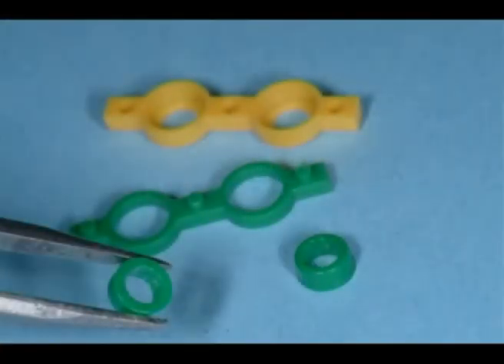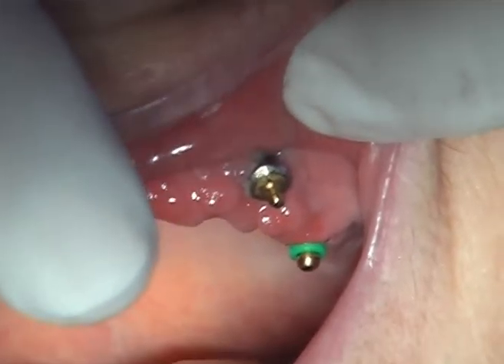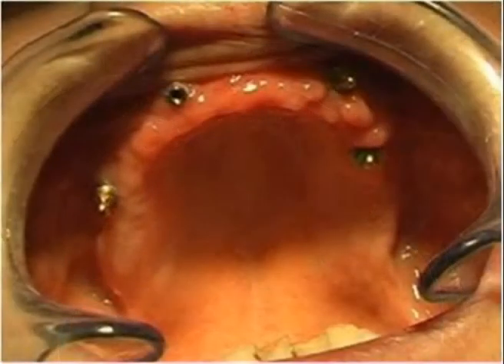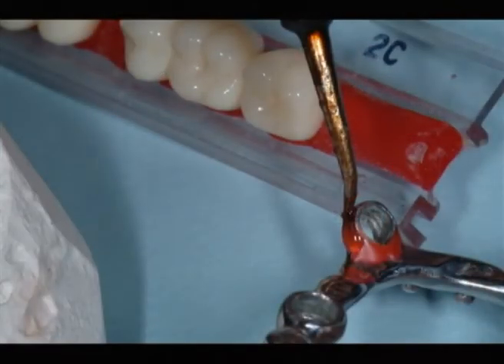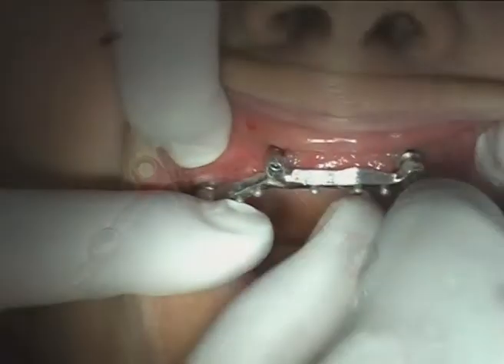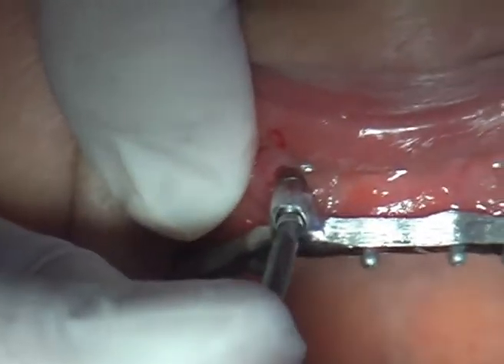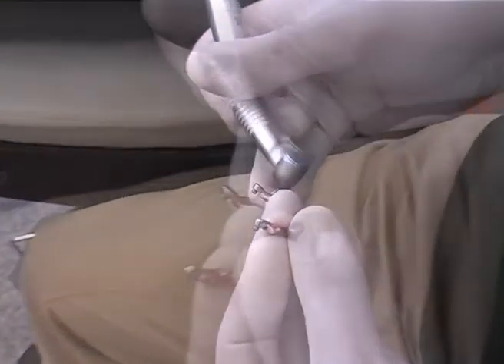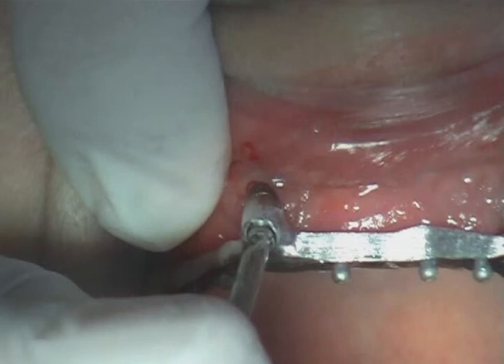The removable overstructure must also be tried in the patient's mouth before cementing the connection bar. In order to give a sort of stability to the bar during trial stage, a green positioner needs to be inserted over the sphere most parallel to the castable abutment screw. In order to detect improper connections between the annular block rings and the spheres, when the bar is in position, it can be helpful to spread them out with some soft wax before inserting. Then remove the bar and eliminate any excesses if necessary.